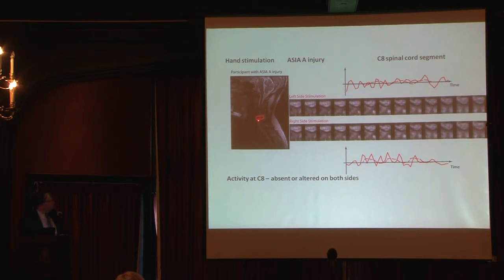And for this example, this might have actually been too high a dermatome level to really look at this person. We really are right within the injury region. You can see by the cross-section. As we get lower down in his, again, 13 millimeter span, we get lower down in this region. We are looking at a little bit more normal cross-section.